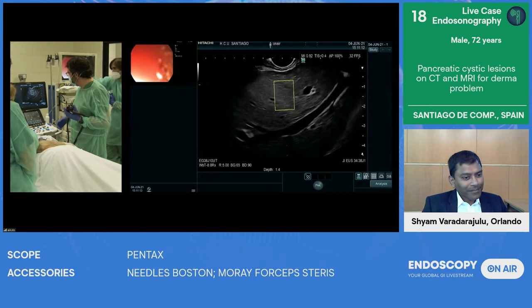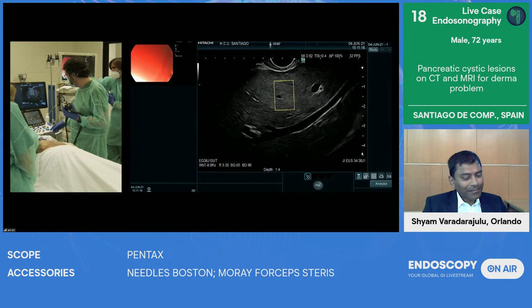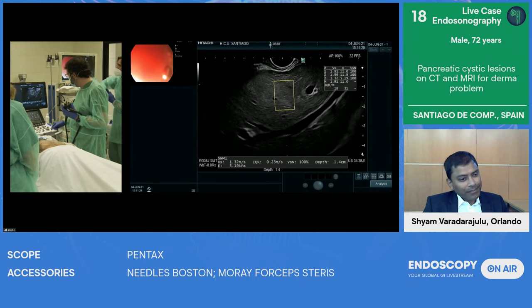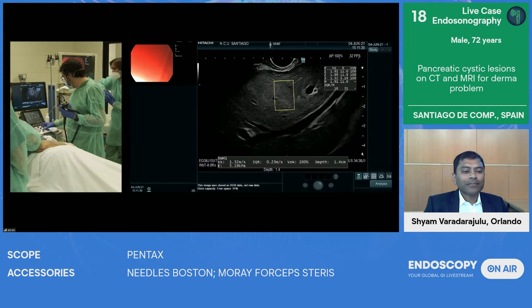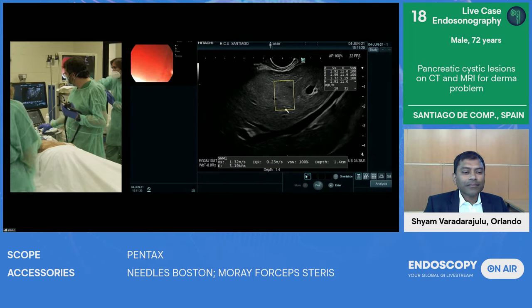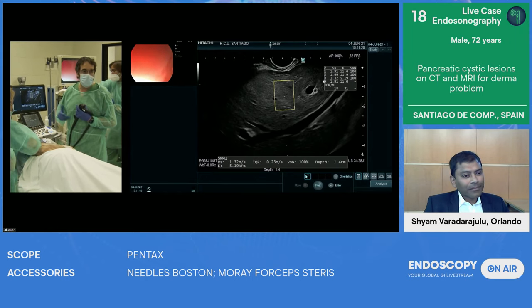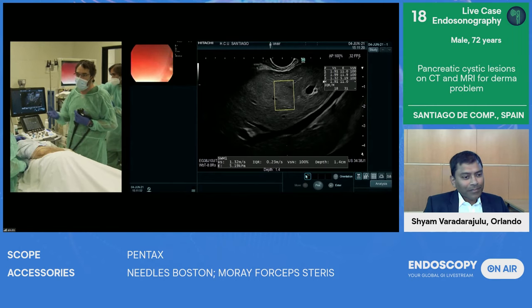So we can just take a box in the liver, and the patient is under deep sedation, which is going to be better for this type of technique. So we are going to perform the shear wave measurement, and we will see in the picture, because we have been doing several measurements before, you can see very nicely on the screen that we can see in kilopascals, and in some different measurements, that today we maybe have the option to measure the fibrosis of the liver, for instance, in a non-invasive way. This is a promising technique that, of course, we need to check. So this is something to show you that is now starting to be available in our systems, and now we are using the 850.